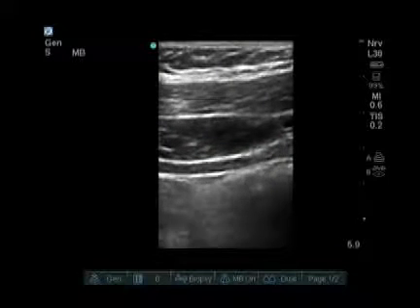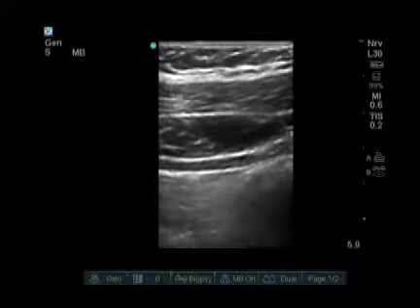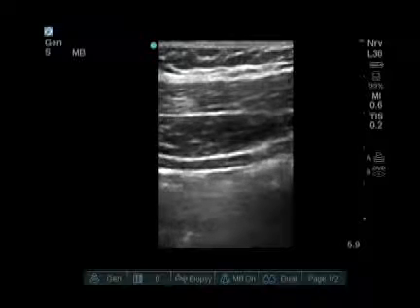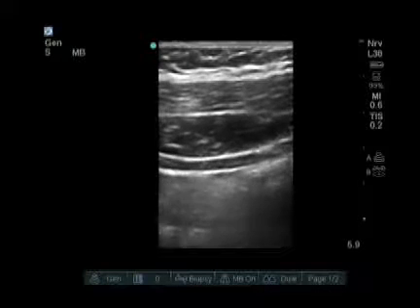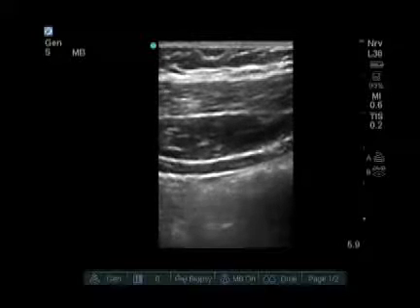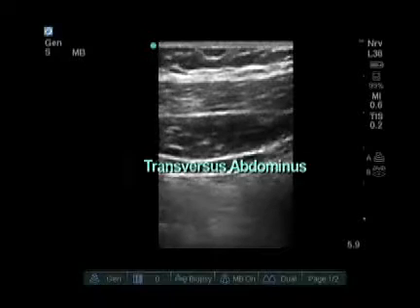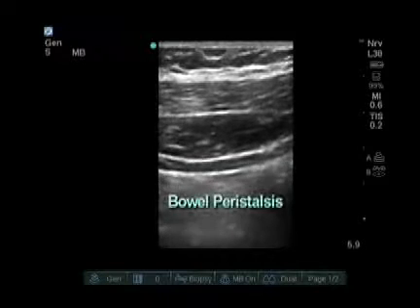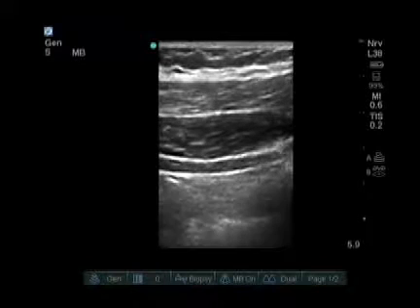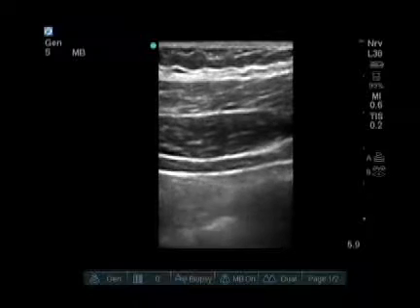Now in some large patients, it's difficult to tell layers because their adipose tissue is quite significant. A good clue is that the internal oblique muscle layer is going to be the thickest muscle layer, just as we see here. The thin fourth layer down is the transversus abdominis muscle, and below that is bowel. It's very important to note that we are getting very close to bowel, so good needle visualization is important for doing this block.